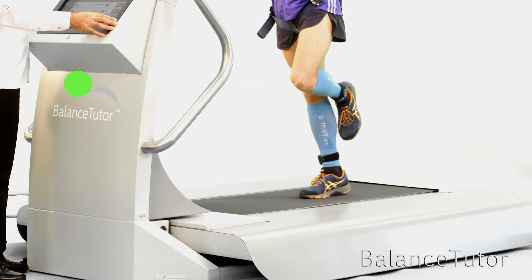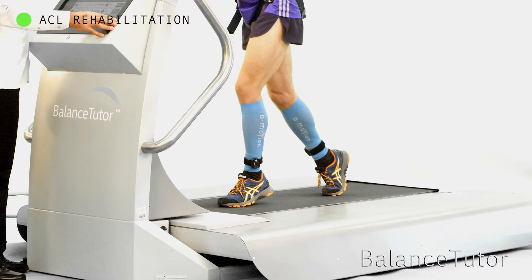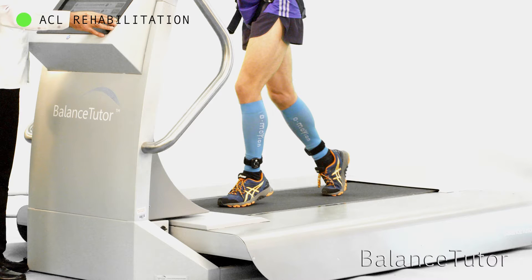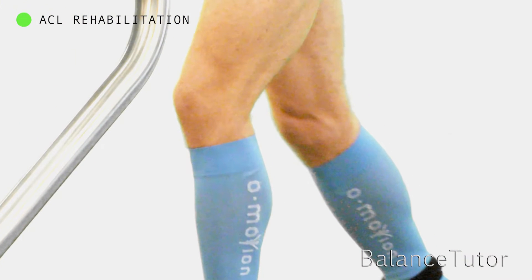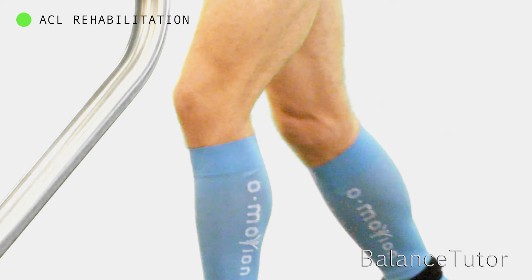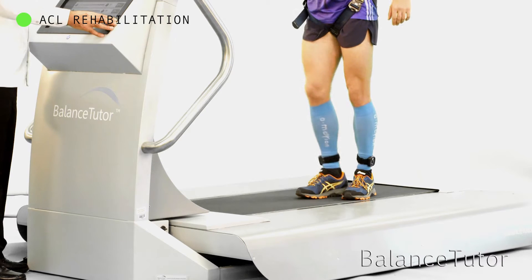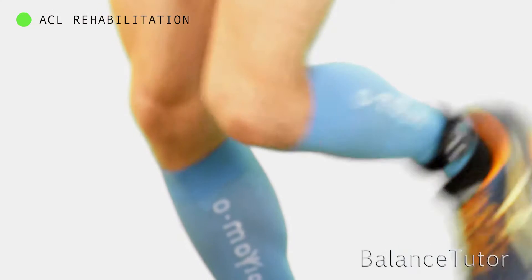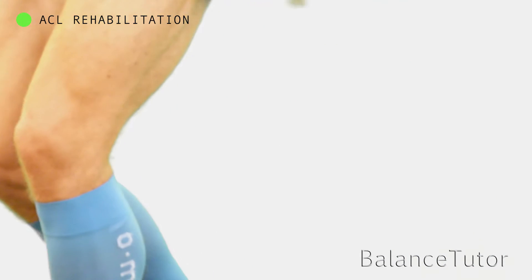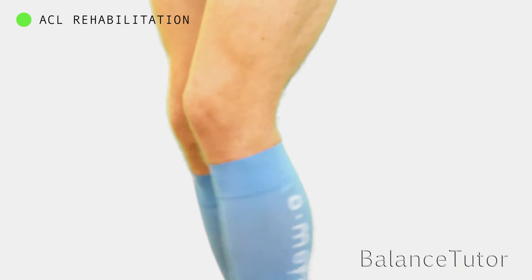The following treatment is unique for ACL rehabilitation. Controlled perturbations challenge the mechanical receptors of the knee to respond quickly and precisely to the pressure on the joint. This results in effective knee muscle coordination and stability.